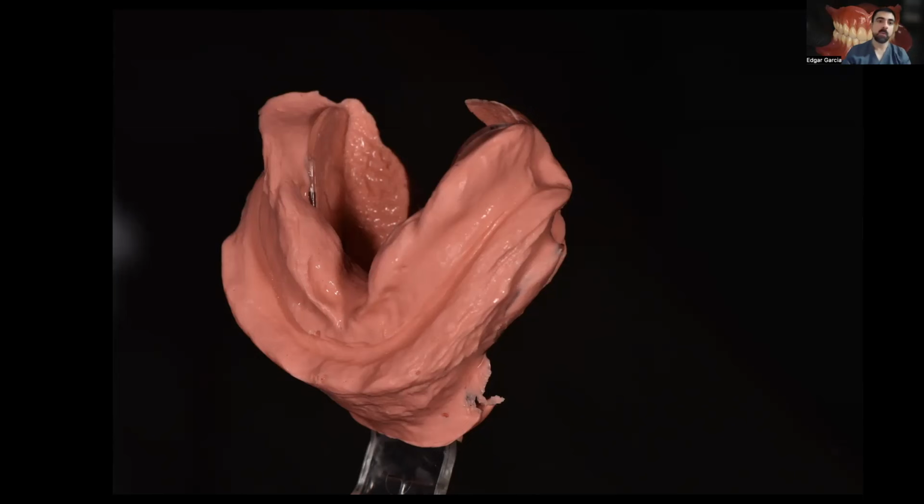You're feeling the suction on your preliminary impression, which is what's different. I don't know if you were able to see in the first video that I showed that sometimes I think it's going to be 50-50 when I do the base plate with the bite rim. Oh, yeah, I saw it. When I try it, I already have suction. Right. With only this impression.